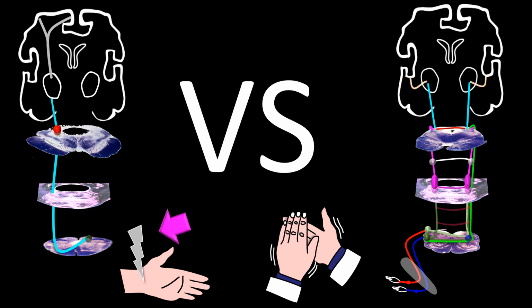Somatosensory evoked potential eloquent brainstem elements are the cuneatus nucleus and perhaps the superior colliculi. The BERA eloquent elements are more numerous.